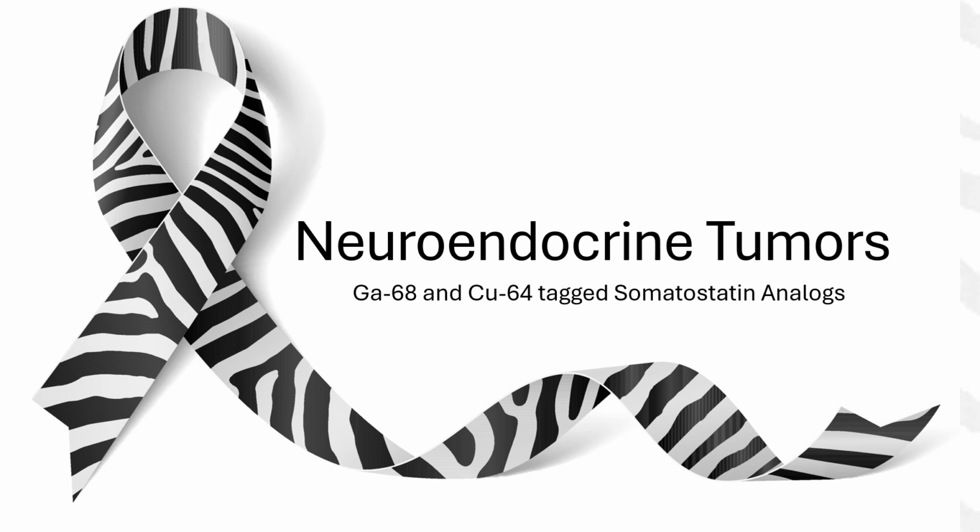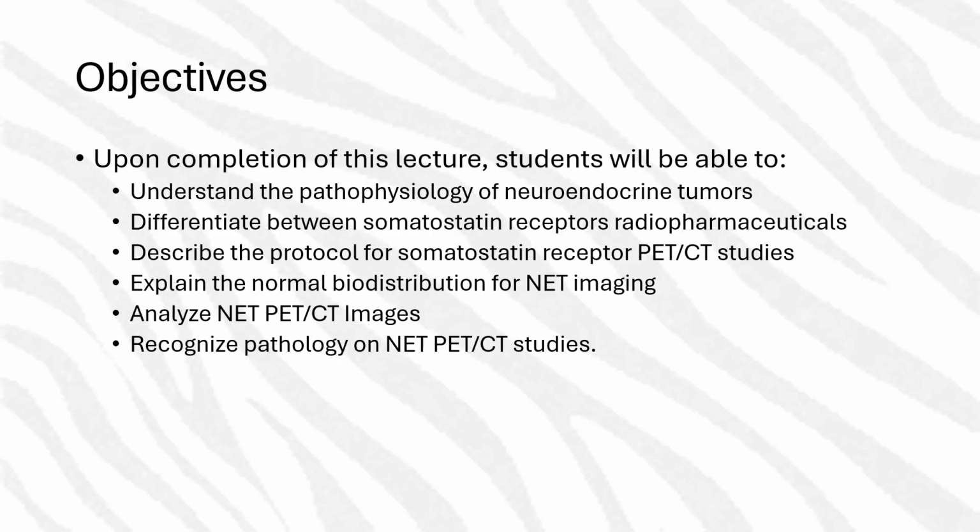Welcome to this lecture on PET-CT imaging for neuroendocrine tumors. This focuses on gallium-68 and copper-64 tagged somatostatin analogs. The zebra is the mascot for neuroendocrine tumor awareness, and so that's why this lecture is zebra print themed. These are the objectives.